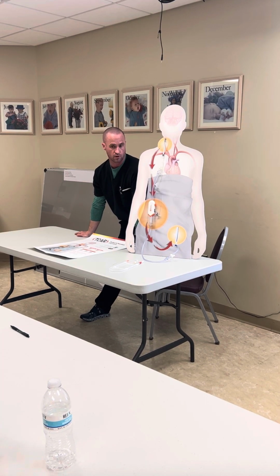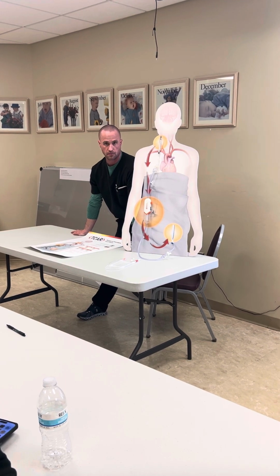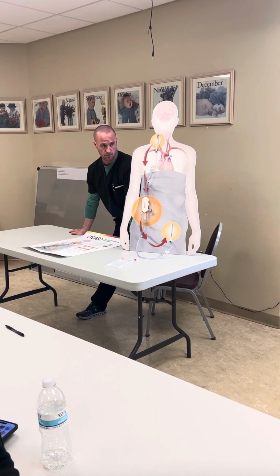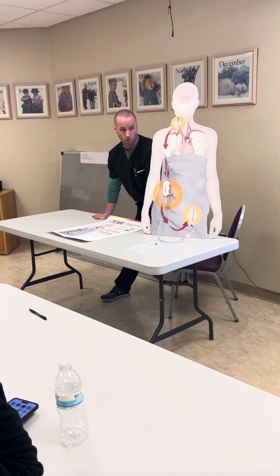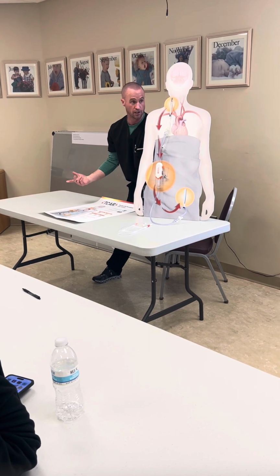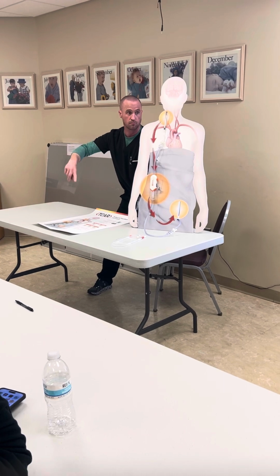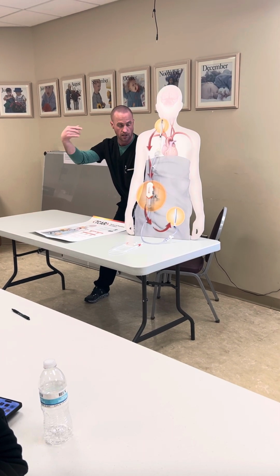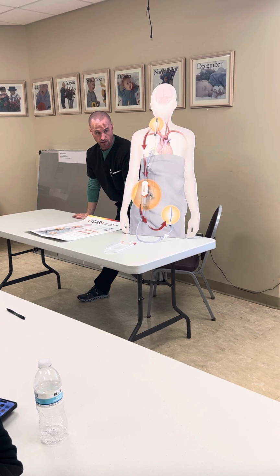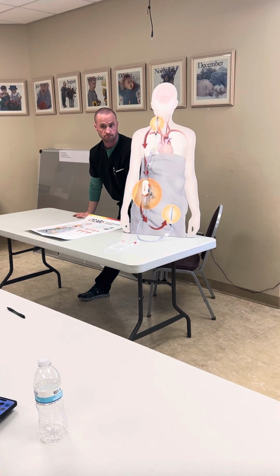And a lot of times what you might run into would be an instant restenosis, maybe the patient has a heparin allergy or something, and they've got quick rethrombosis of the stent, which is unlikely, or maybe you have a flap at the access site, which you didn't notice under angio. But usually we take a lot of serial angios post-op. We'll take an LAO 30 and RAO 30 just to look at it from two different views. And once we all agree that we're good, we're pulling wire and coming off clamp, and we're done.